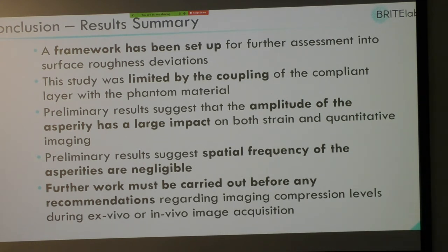Preliminary results for ex vivo scans are that the stiffness of the stress layer is actually more stiff than the breast tissue itself. And as you increase preloads, you increase the size of these gaps. So there does need to be an investigation there.